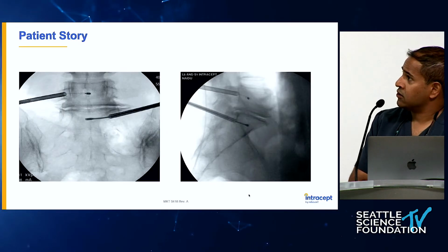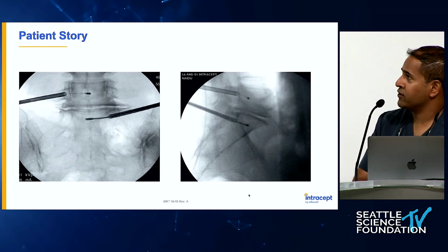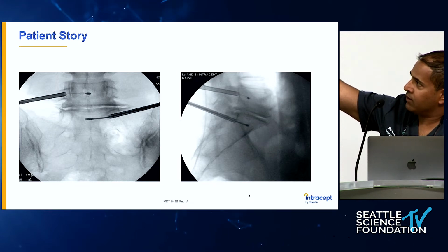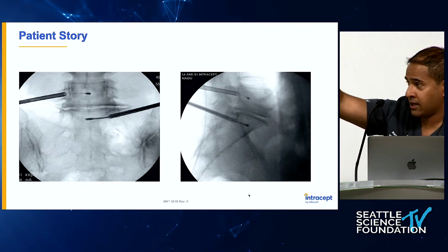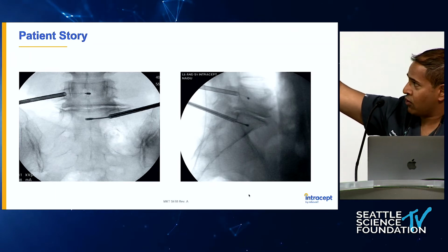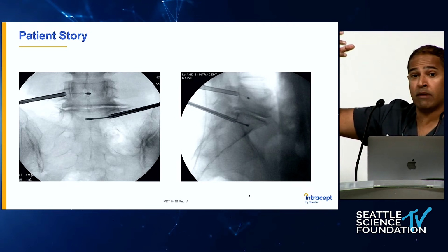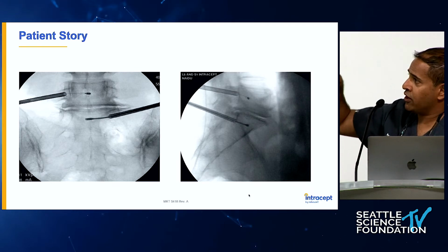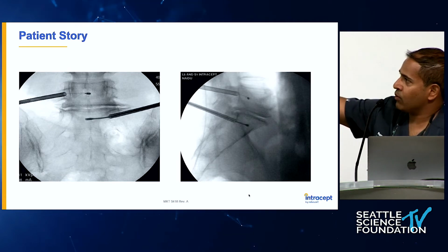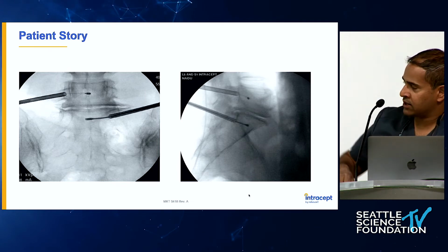Beautiful. So these are my intraop fluoro shots, and we'll talk about this when I do it. But as you can see at my L5, I'm basically at 25%, which I personally love. Doug, do you like that? Okay, cool. And at S1, S1's interesting. So we're right now still saying 50%. I still think we should be a little more posterior, maybe 40%. And the issue there is the BVN might be bifurcated or coming in at 2 different entry points. Nonetheless, the way to look at this is look at that superior end plate of S1 and then see where the target zone is here.